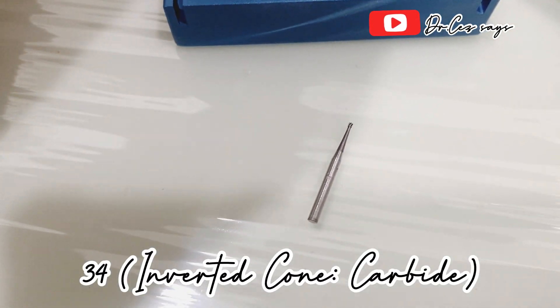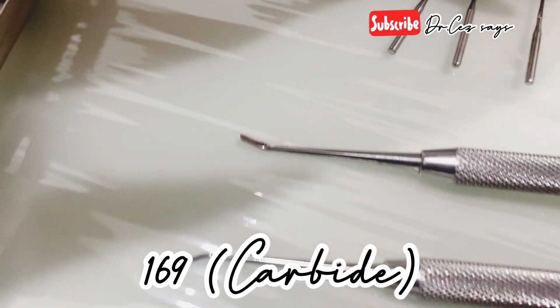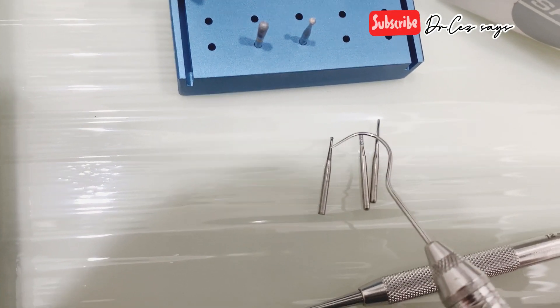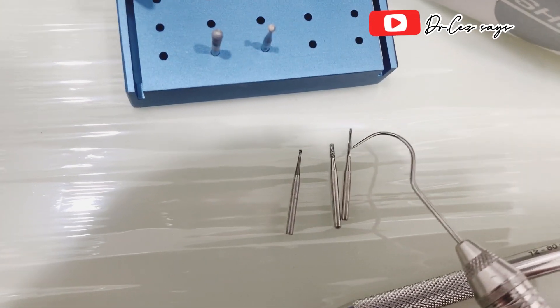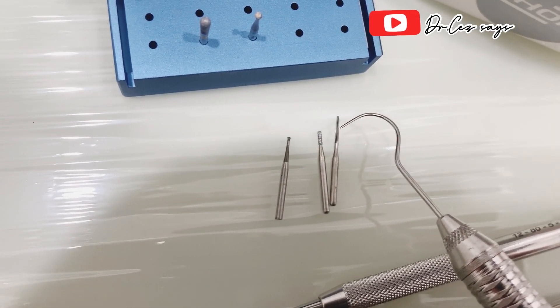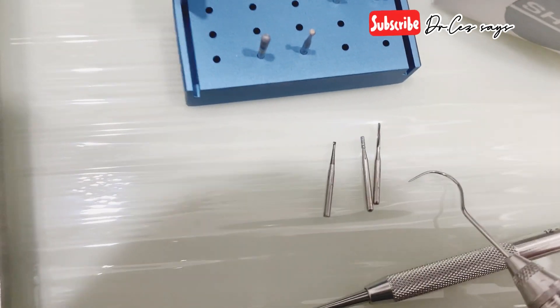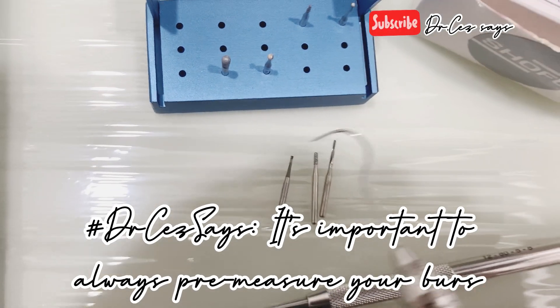My inverted carbide, my straight diamond, and lastly my straight carbide. I use the inverted carbide to flatten the floor and create the initial outline. Then I use the straight diamond to shape up my walls and do the proximal ditching. Basically I only use these three burs to finish my Class 2 amalgam preparation.